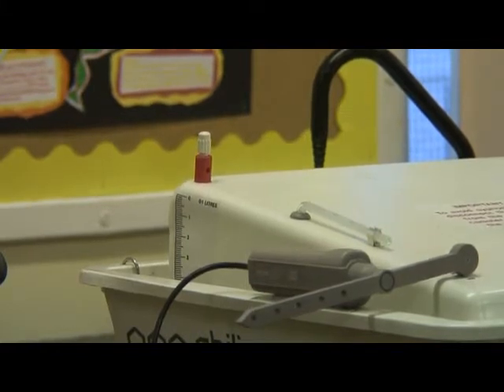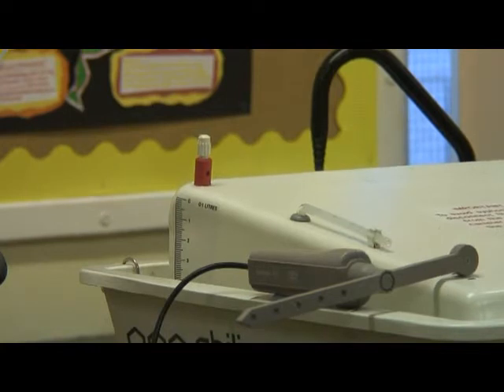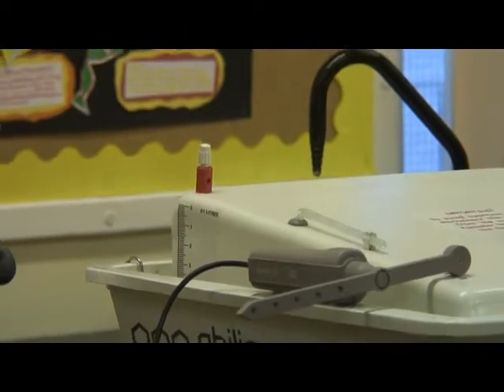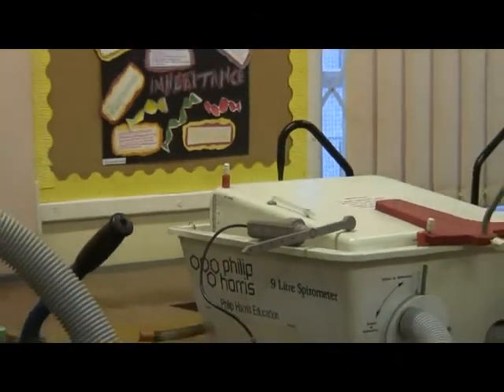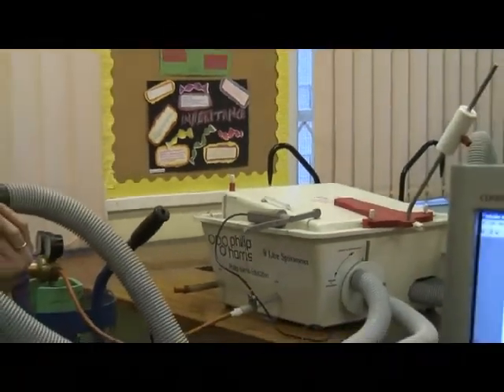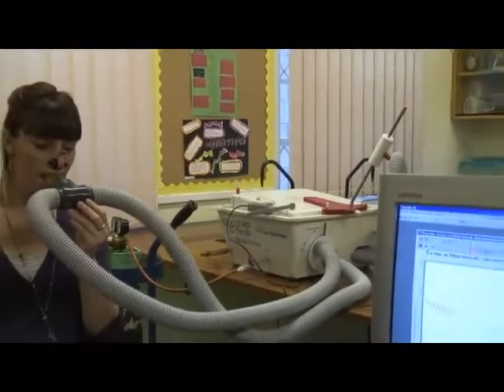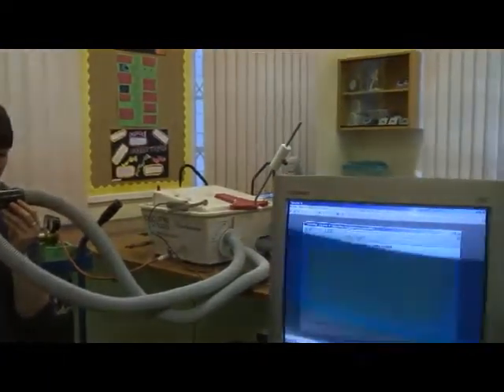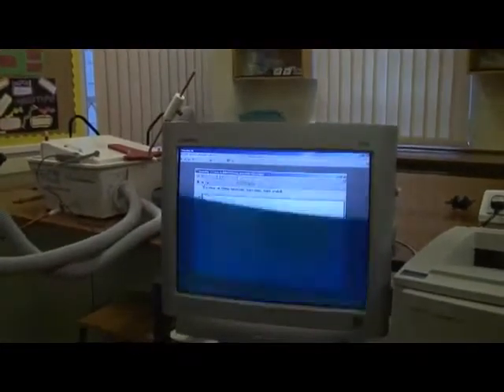Here's a closer view of it. Measurements can be made directly on the lid, but in this case we have the grey piece of apparatus with a wire coming out of it on the left — this is a movement sensor which is attached to the computer, which will detect those movements and translate them via the computer and display them on the video screen as you can see now.